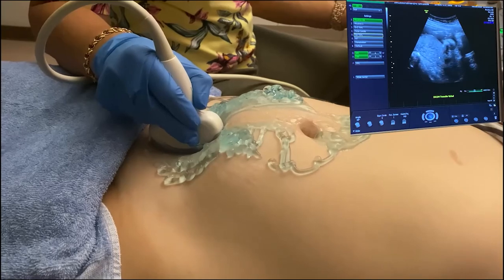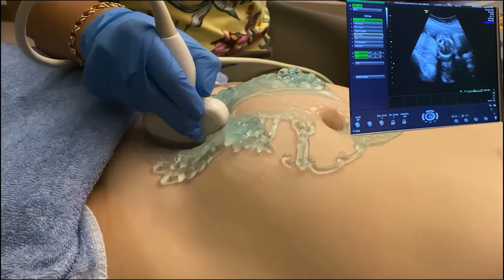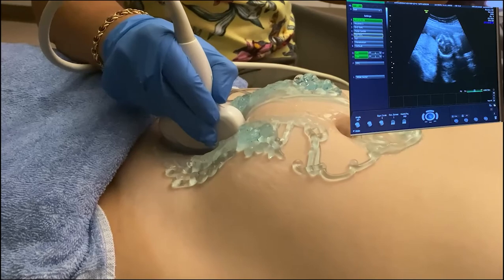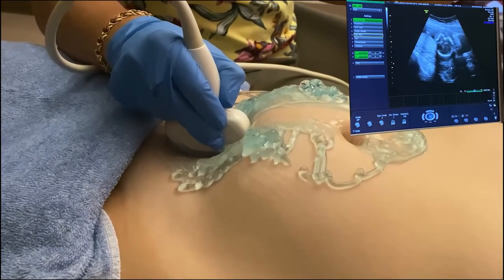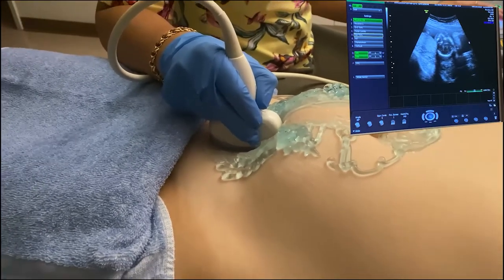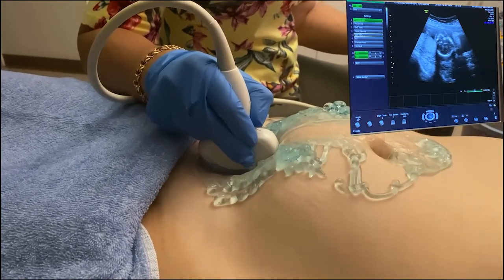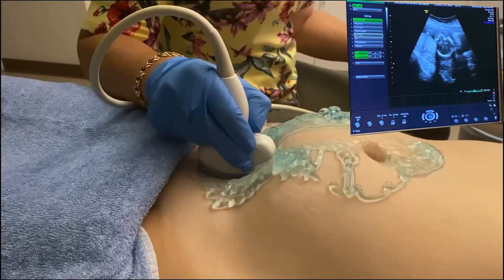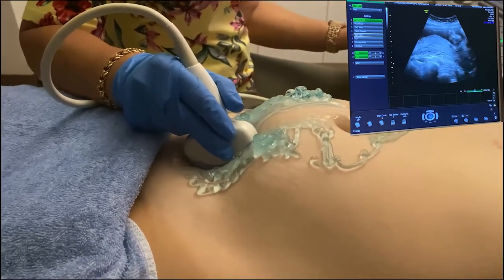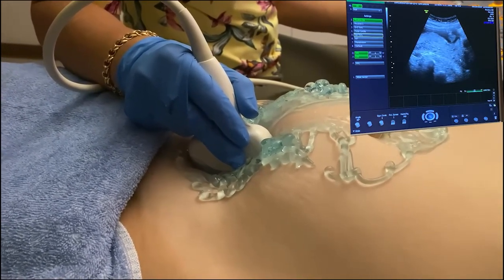We see that the baby is head down. Head is oblique, looking sort of to the anterior portion of the uterus, but this gives us a lot of information. We see here is the base of, or the posterior portion of the cervix. This is vagina. This is mom's urinary bladder, the anterior uterine wall, and the posterior uterine wall. And this is the placenta. The placenta is way away. This is the internal os here of the cervix.